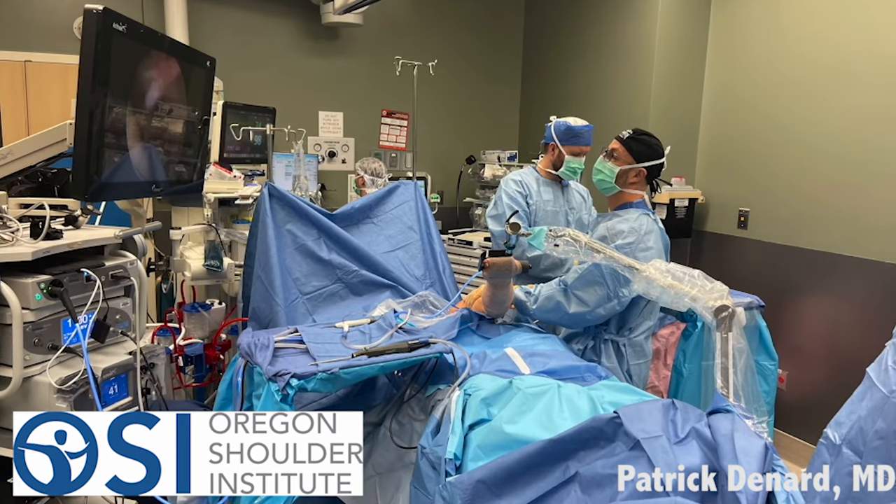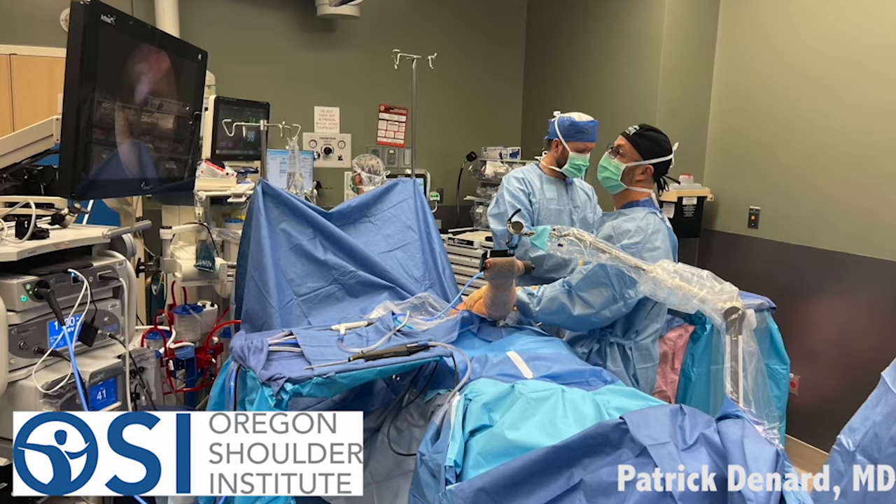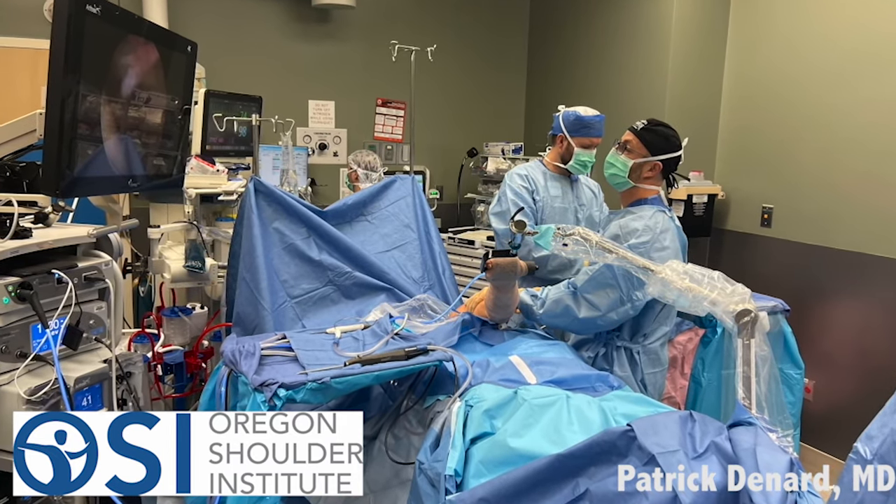We can look at the scope. We have an assistant above the surgeon, and then there's a scrub tech behind. They help us assist, and we're working off instruments on both sides.